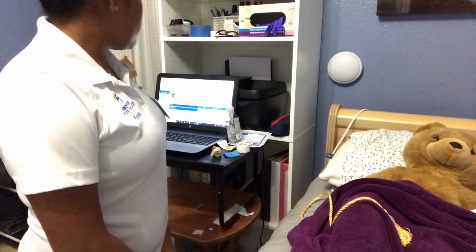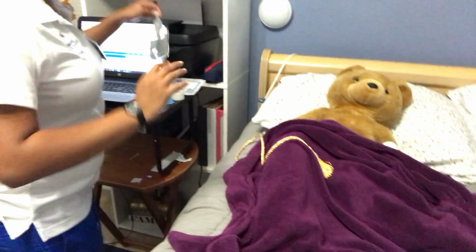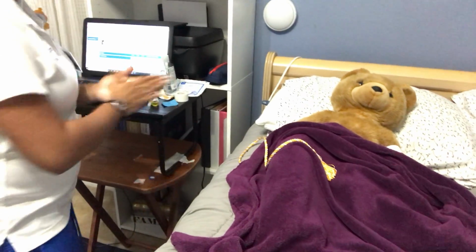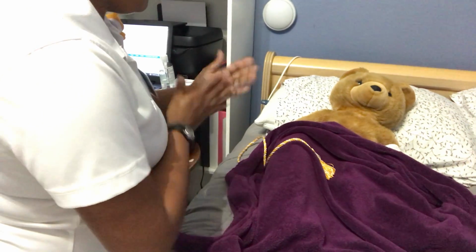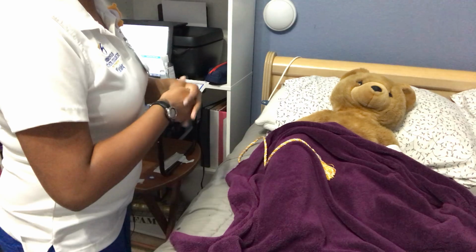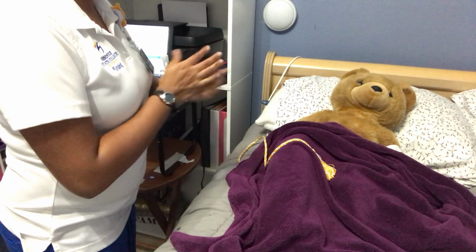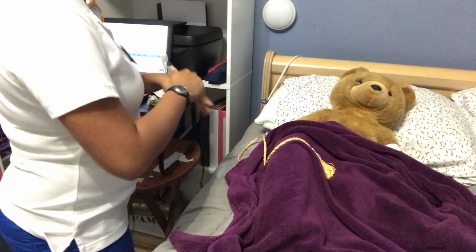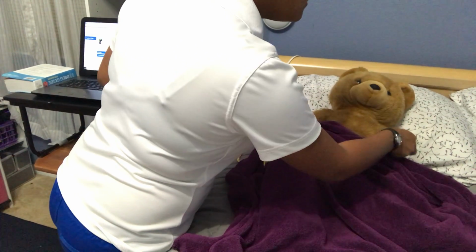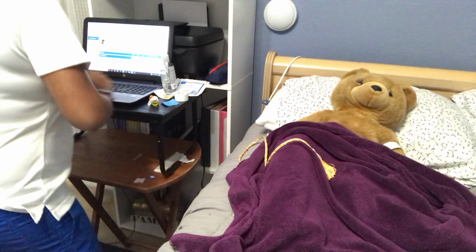Can I come in? Yes. Hello, my name is Samantha. I'm a nursing student. I'm here to administer a medication by subcutaneous injection. Okay? Okay. Can I get your full name and date of birth, please? Oscar Simpson, XXXXXXXX. Okay, can I look at your ID bracelet, please? Yes. Okay. Alright, now I'm going to compare the chart.